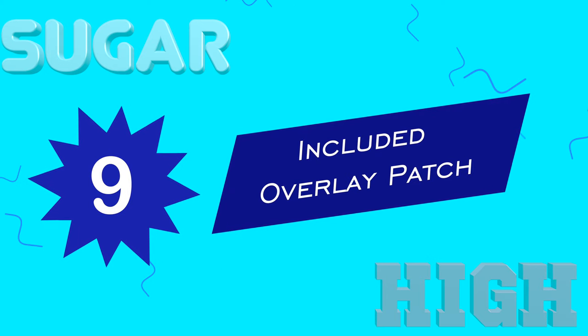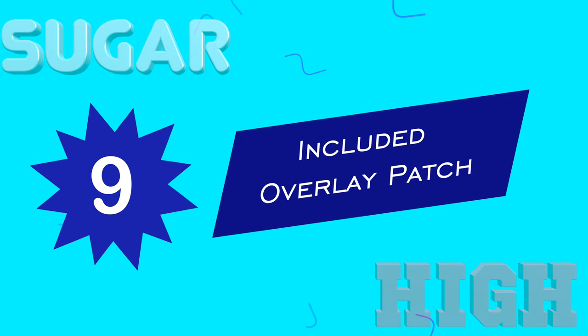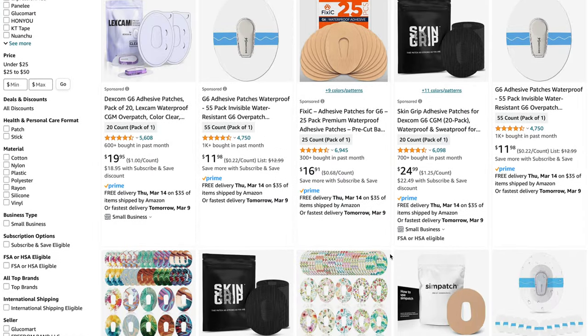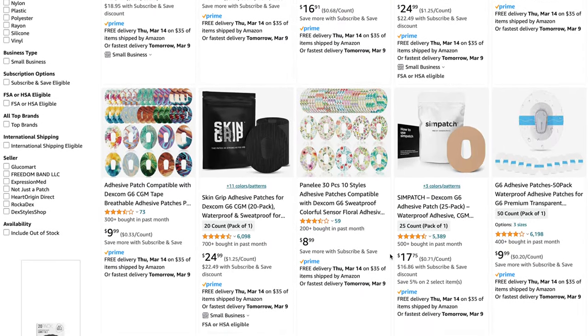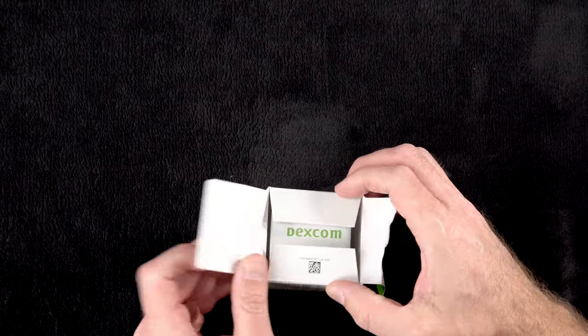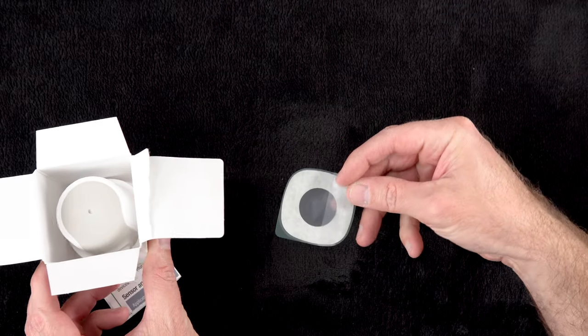Number nine is that the Dexcom G7 comes with an included overlay patch in every box. Probably the most common complaint I hear from patients is that these things just fall off sometimes, no matter what the brand is. A lot of people buy aftermarket overlay patches like Tegaderm or other adhesive patches specifically made to keep sensors from losing their adhesion and falling off before the replacement date. Well, Dexcom apparently decided to just own that fact and included the overlay patch for you, so you can put it on to give it a little extra hold. That's a nice little bonus.